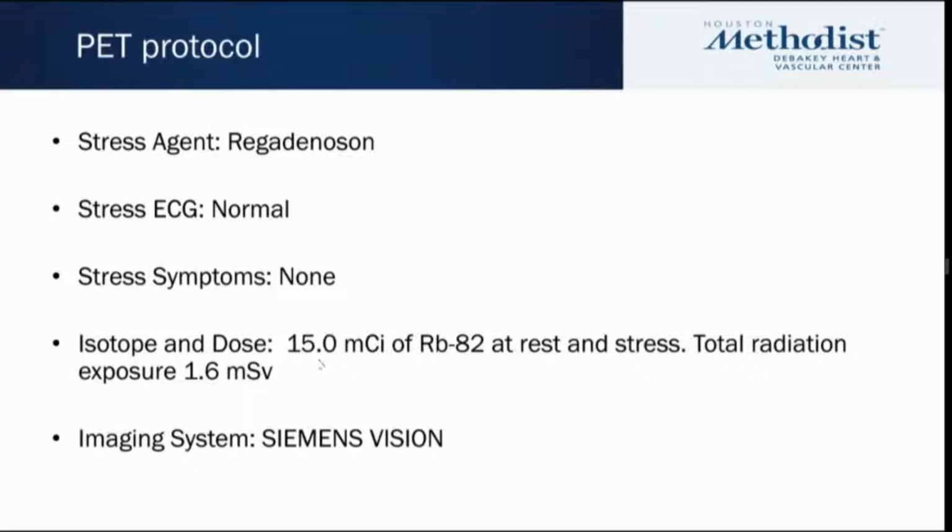So if we have anyone from the audience who doesn't have a digital PET, we're not going to be able to give this amount of rubidium, and you may need more. But this one is accomplished with very low radiation, comparable to what we are achieving nowadays with CT and others.